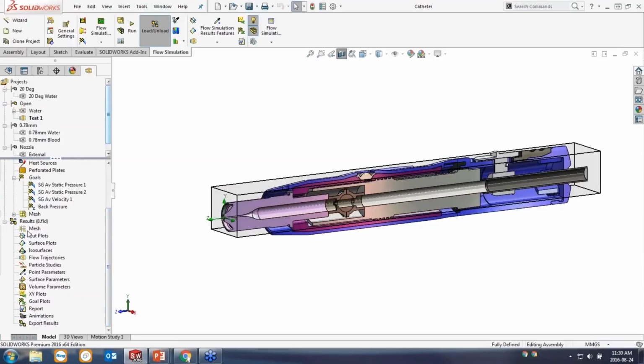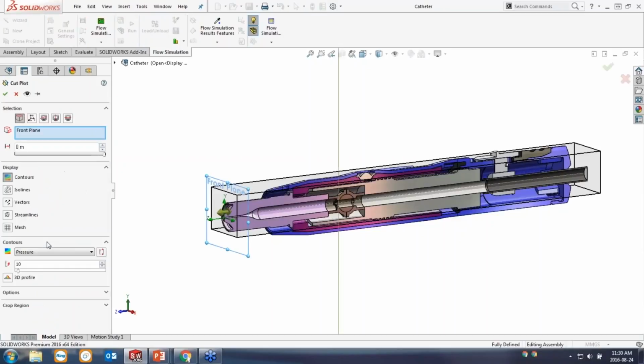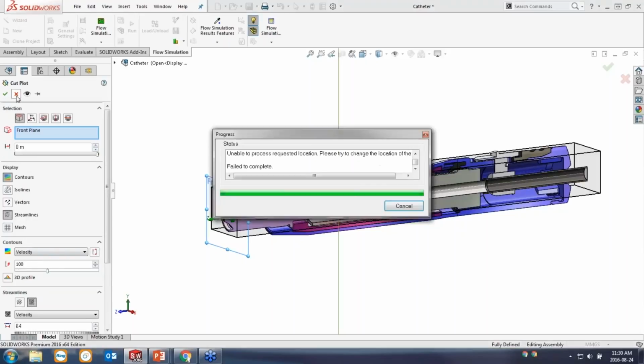There are many different ways that you can post-process the results. The first thing that I usually like to do is to take a cut plot, which is basically exactly the same as the preview plot that we were looking at. You can track different values just like the preview plot: pressure, velocity, temperature, if you're doing a thermal analysis. And you can also overlay things like streamlines to get an understanding of where the flow direction is.